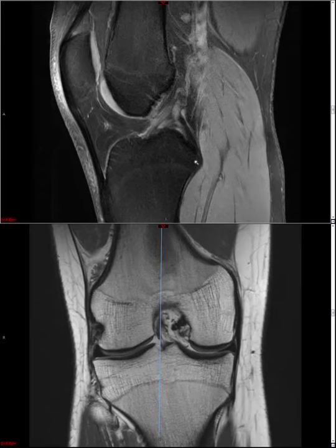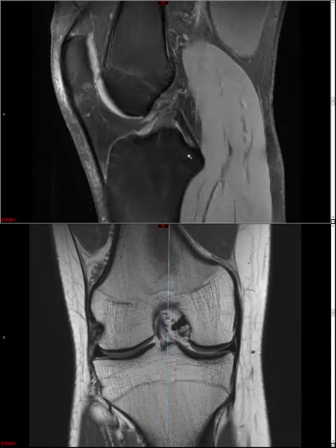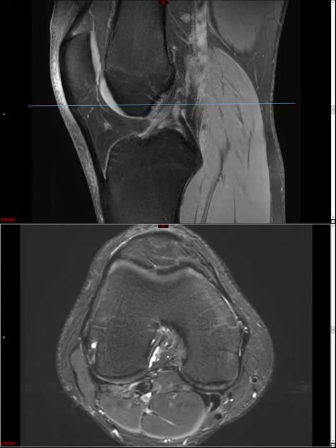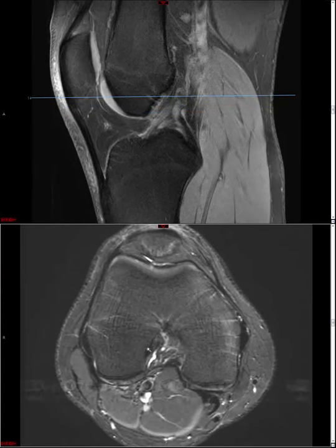If it's a complete tear, it's also helpful to say if it's from the femoral attachment, mid-substance, or off the tibial insertion. A very common example of a complete ACL tear is one where the tear is right at the femoral attachment, and instead of seeing that nice femoral origin, you just see white here or increased signal. Then you'll typically see an abnormal horizontal lie of the fibers on your sagittal. So that should be an immediate tip off.